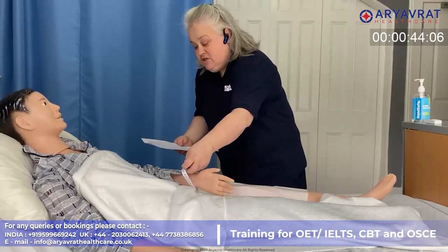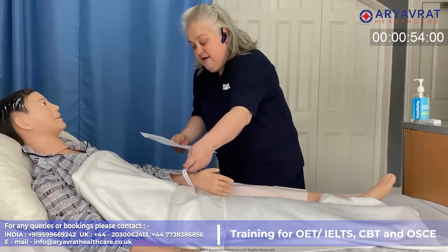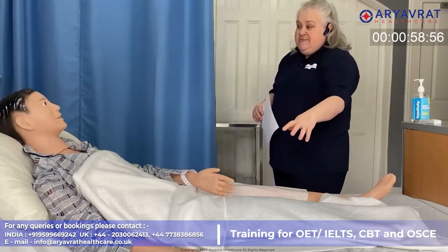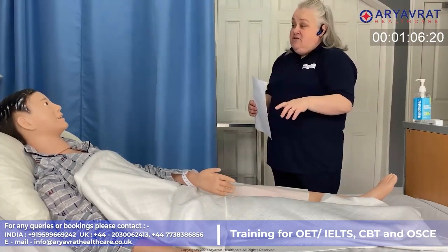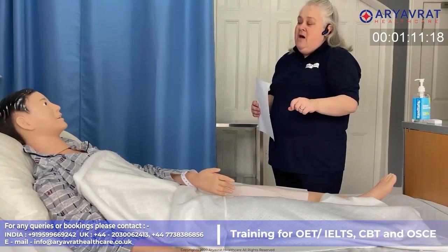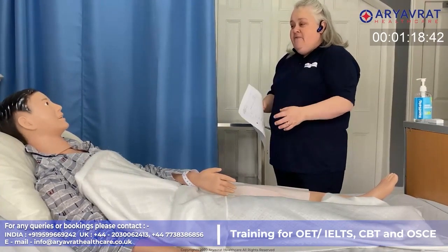Okay, Raj, I'm just going to cross-check that with your wristband. So, Raj Palmer, 20th of the 11th, 1962, and your hospital number is M45673P. Super. Right, I understand the doctor's just been here and had a look at your wound, so you need a new dressing, is that right? Yes, it is. Okay, I'm going to come and do that dressing for you, but before I do that, I'm going to update your wound assessment. The whole process is going to take about 10-15 minutes, so do you need anything before we start?